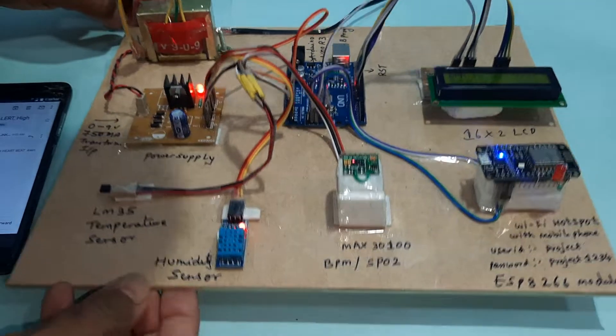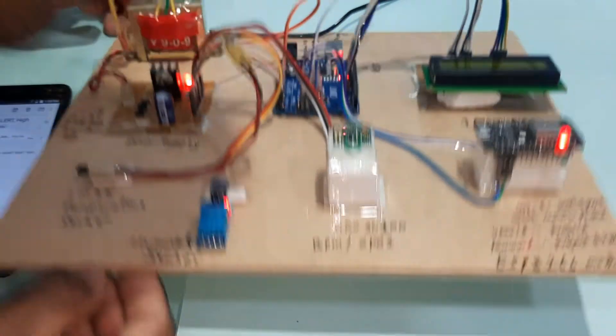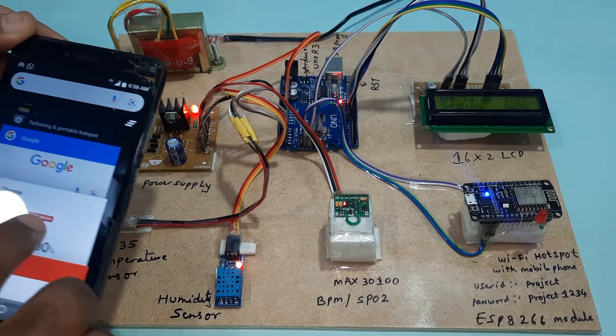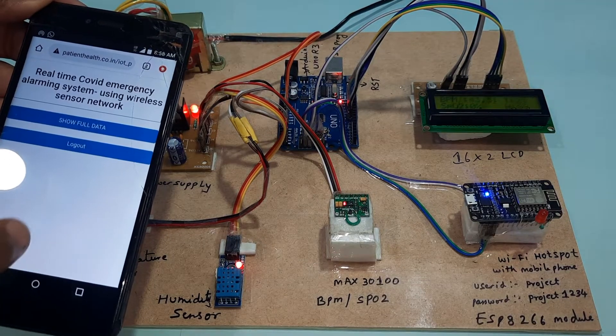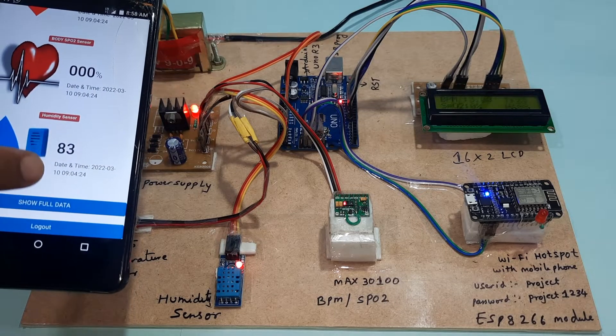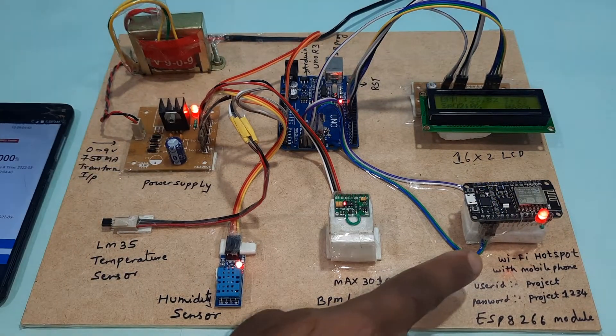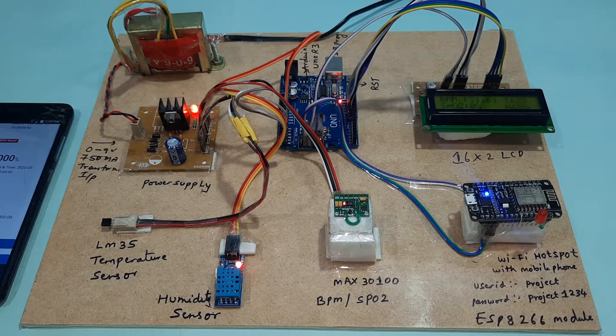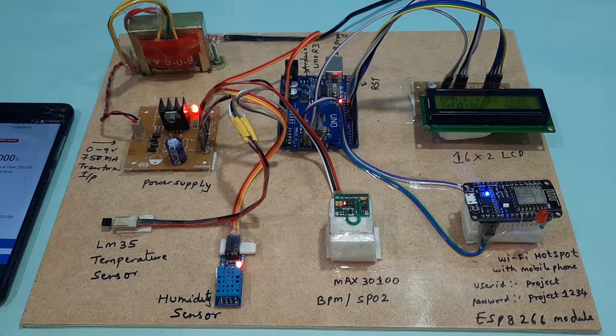Now demonstrating the humidity alert — the humidity reading reaches 88, and data is pushed to the server. Then demonstrating the temperature alert: the temperature crosses 50°C and above, triggering an email alert as well.